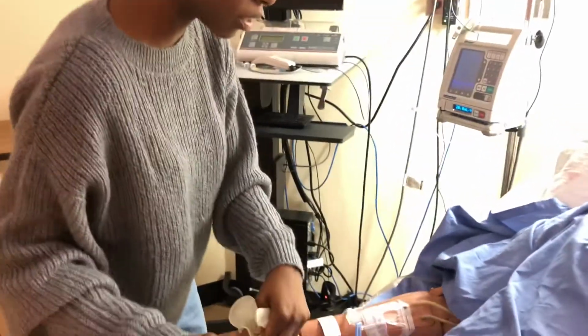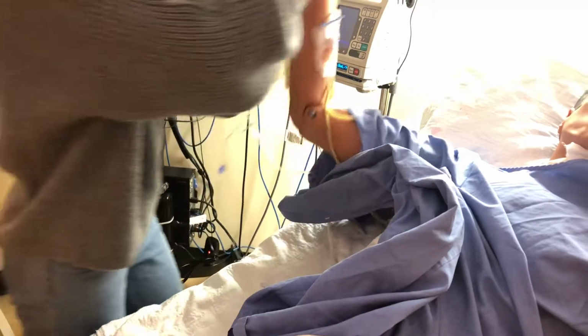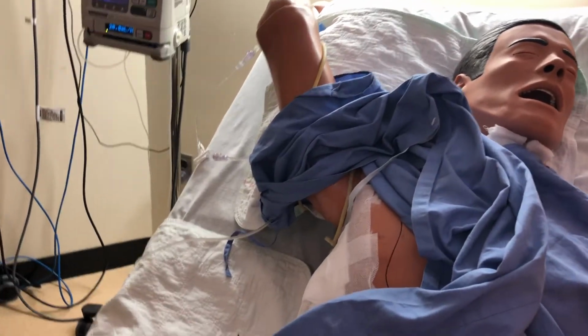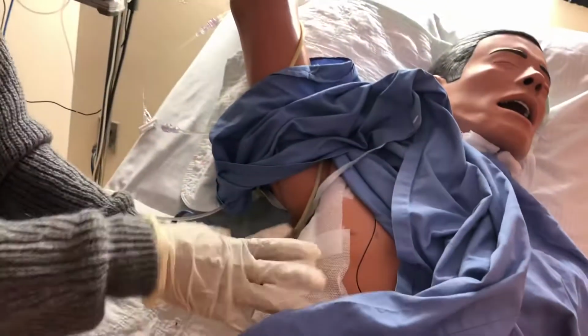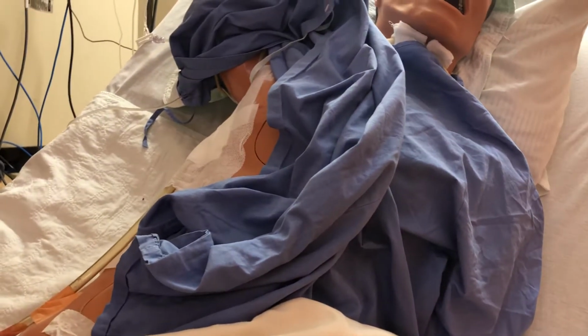So I'm just gonna check the site, if that's okay. I'm gonna raise their hands up. Okay, so I'll wear my gloves. I'm gonna mark where there's a line with initial. So the site looks dry and intact. I'm feeling for crepitus. There is no crepitus. I checked the tube. Okay, there is no kink, there is no clamp, there's no clots. And it's coming from here to the drainage system.